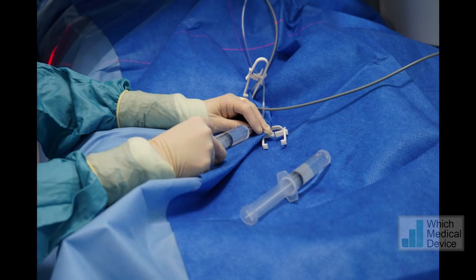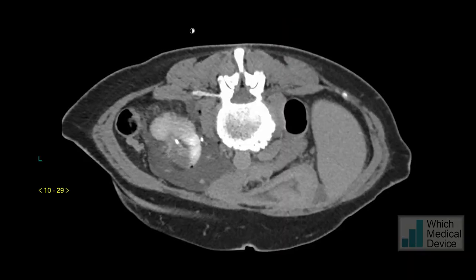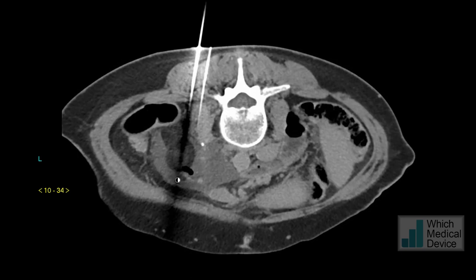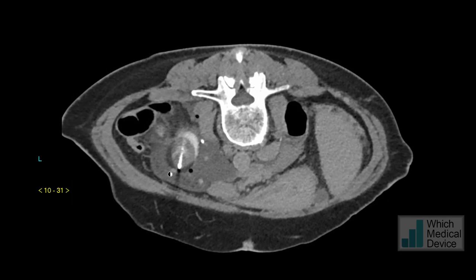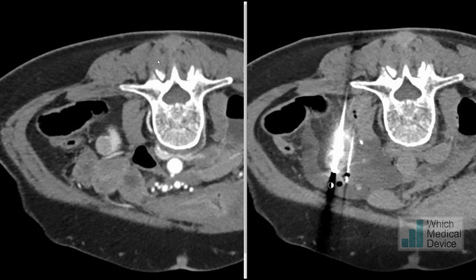We continually inject saline at the hydrodisection site, then perform active thawing for a further minute. At the end of that, we check with a further CT scan. You can see the needle within the middle of the lesion, the hydrodisection needle alongside it, fluid around it, and a clear low attenuation ice ball that more than encompasses the small renal mass. Seeing this ice ball and its diameter, we can be very confident we've successfully ablated the tumour. Putting the pre- and post-ablation CT scans side by side, the ice ball on the right-hand image has clearly encompassed the area of the original tumour visible on the left.